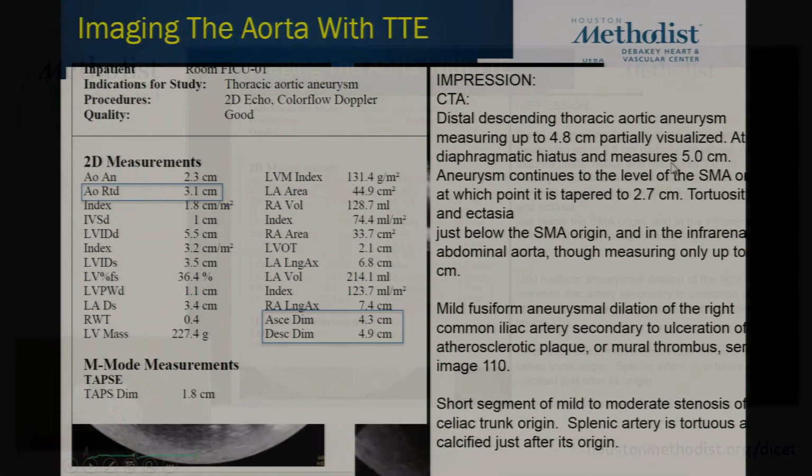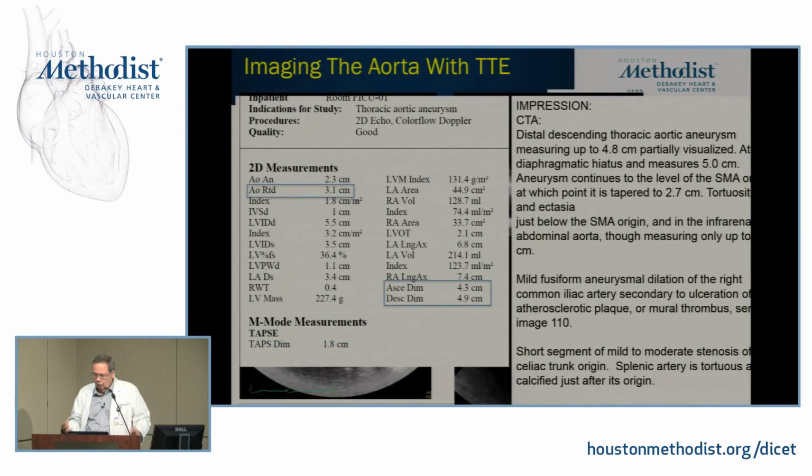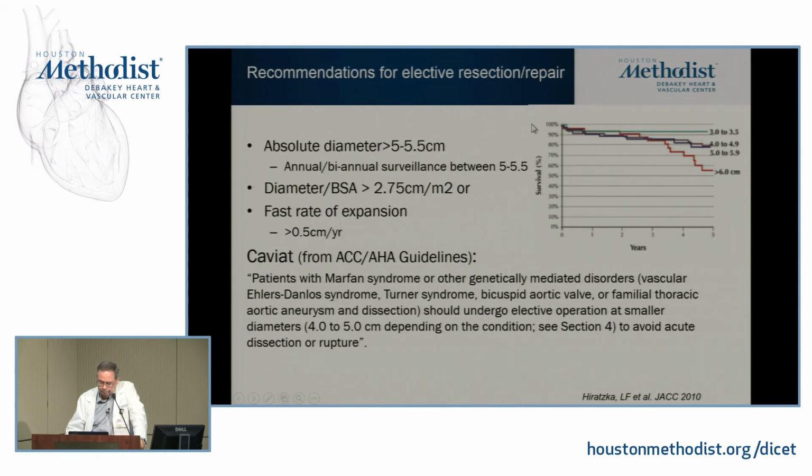So, I think that we can frequently obtain measurements that do agree with CT or CMR on a patient by patient basis. If you're able to get good imaging, good agreement, then that could change how you do some of the serial assessment. Personally, my own bias is that I would do that more for ascending aorta and less for descending, because I think descending obviously has a lot more complications and tortuosity and issues that I would trust better doing a serial CT or CMR.